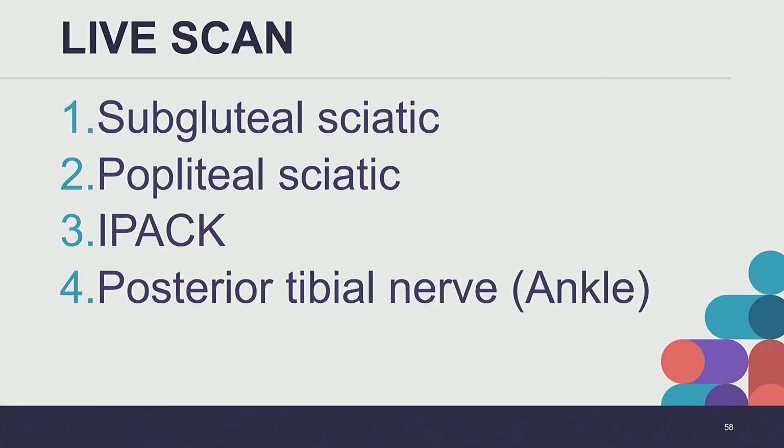So typically the nerve that's going to be right on top of the artery is going to be your tibial nerve. And then to the lateral aspect, which is the left side of the screen, we're going to look for the common peroneal to come in and join it. They're coming together, and they're together. Common peroneal, posterior tibial.